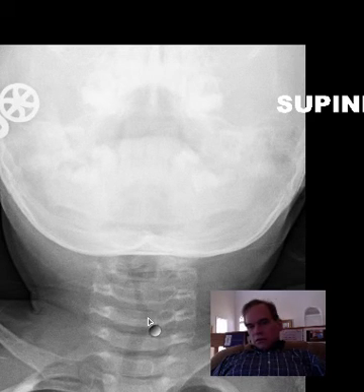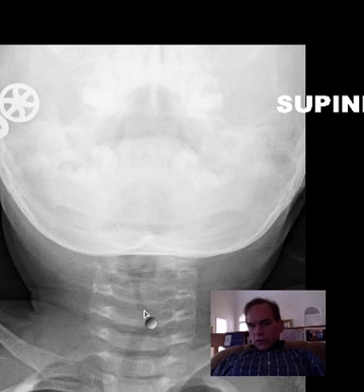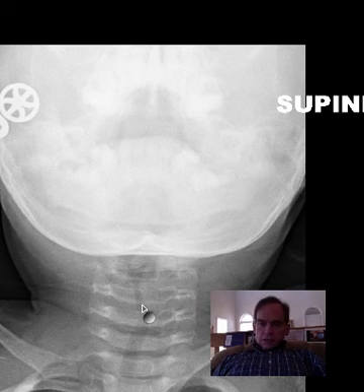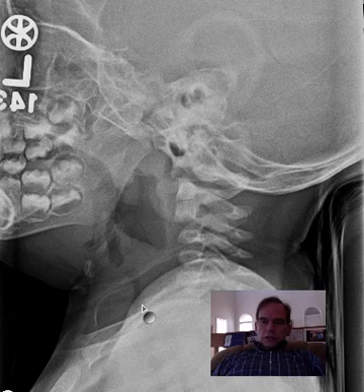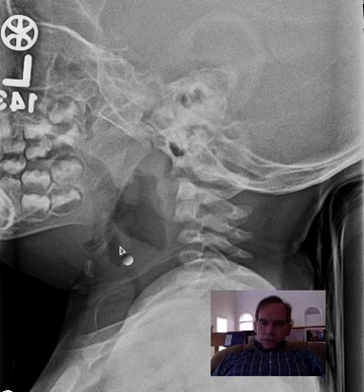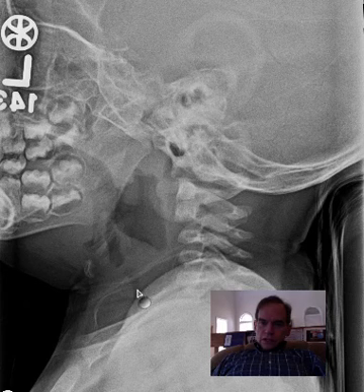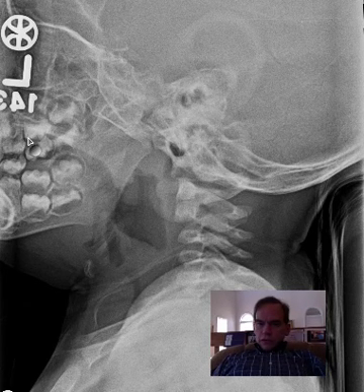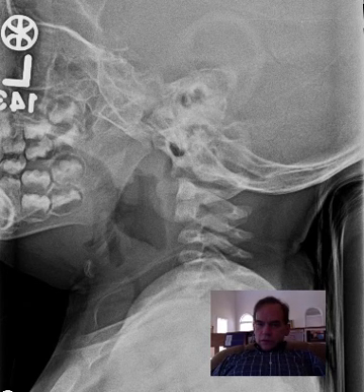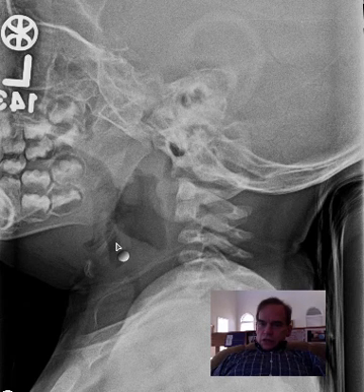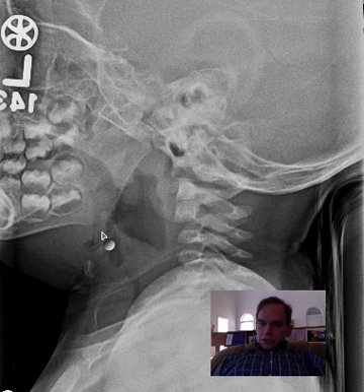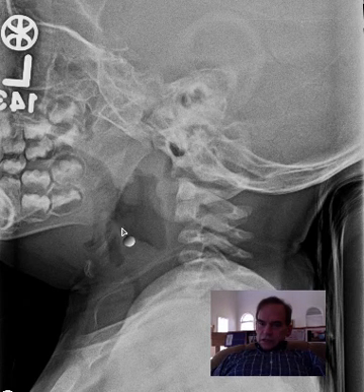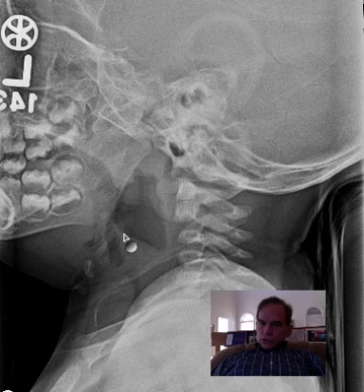We have this length of the subglottic airway that is narrowed and visibly irregular. And in the lateral view you can see that right here. So we're going from the mouth down to the lungs of course to breathe.